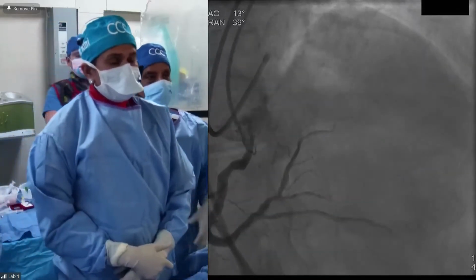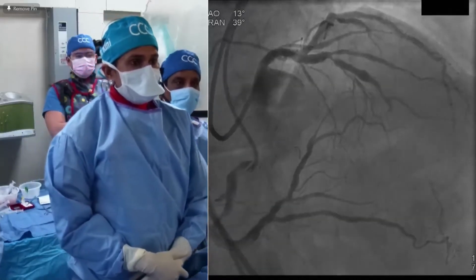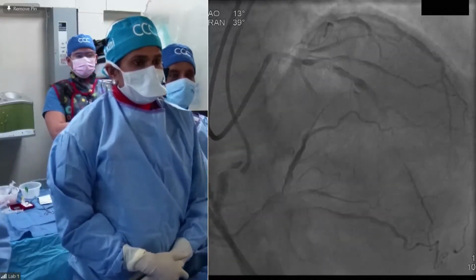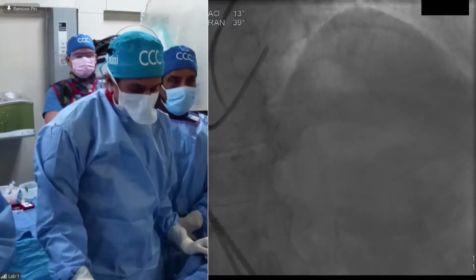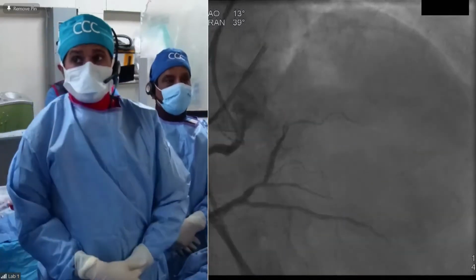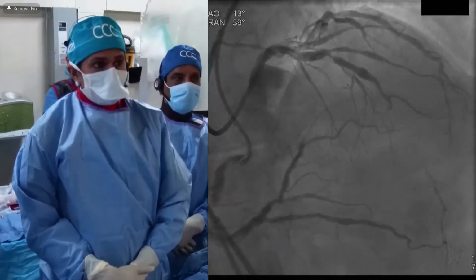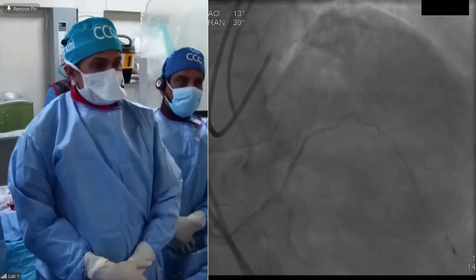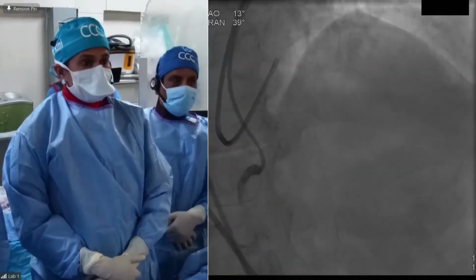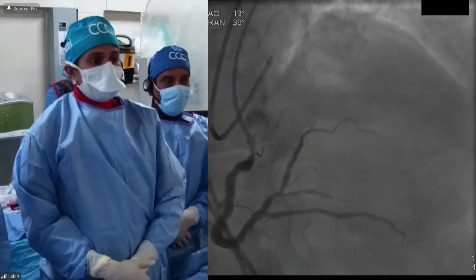Clearly this is a very good case for Dr. Puskas, but this patient I actually took care of about 4 years ago. At that time, the LAD-diagonal bifurcation lesion was there, but about 70%, and the RCA had a discrete lesion, and we put one stent about 4 years ago.